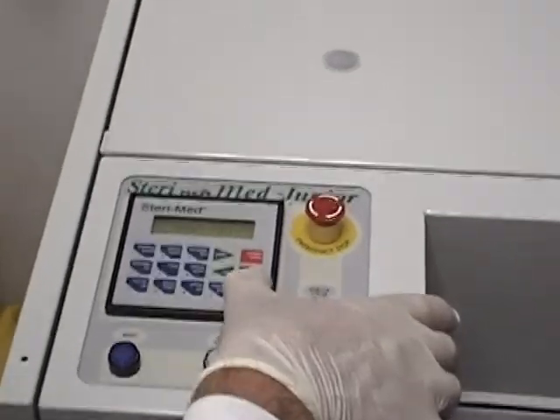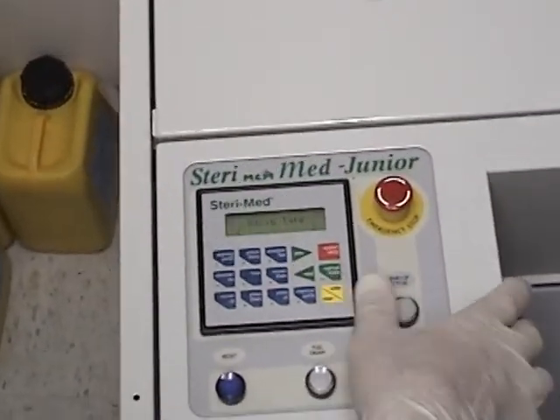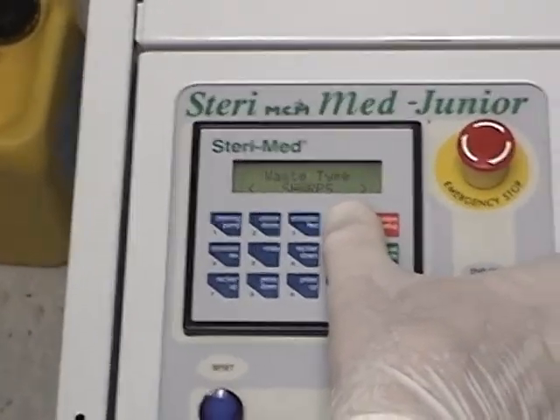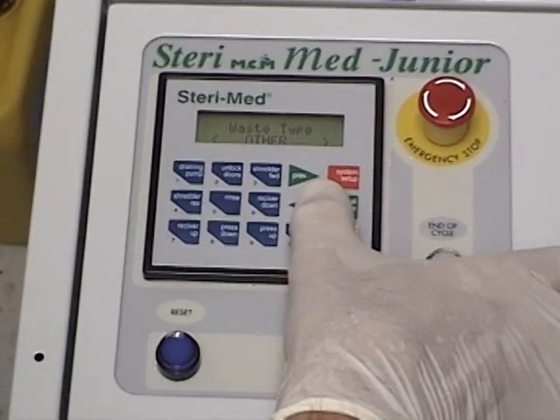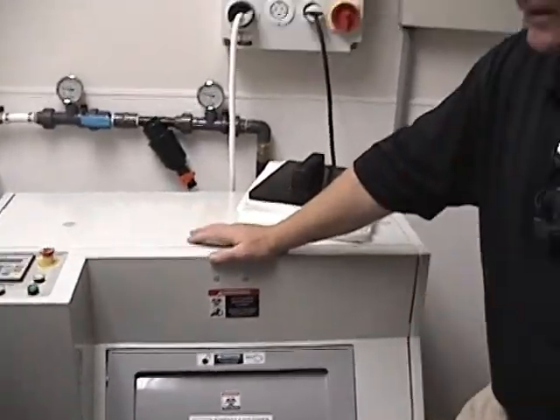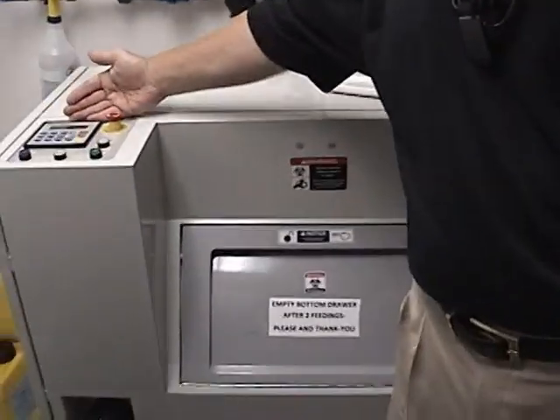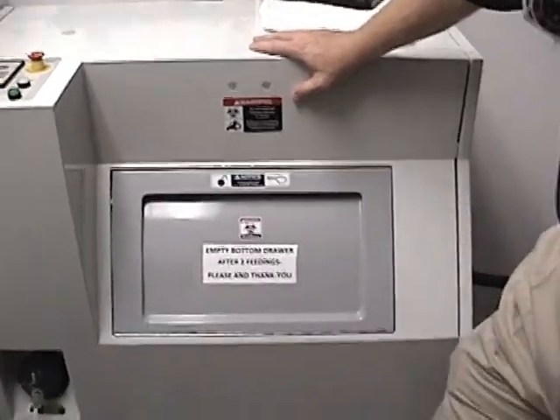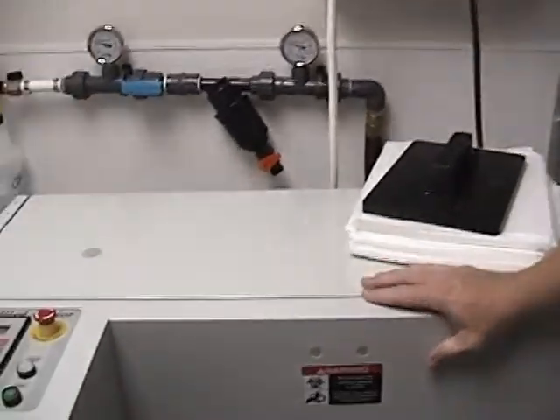He's going to select the waste type. He'll hit this, hit the start button, and then the machine asks: do you want to do sharps, a red bag, or other? It'll prompt him to confirm yes and then the thing starts filling, telling you throughout the cycle what it's doing. In a second it's going to start shredding — the blades are going to go into action and start chopping.